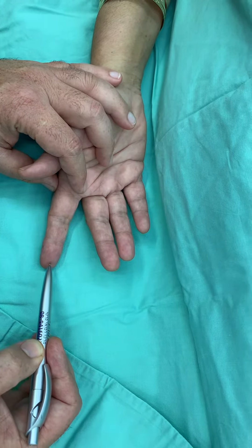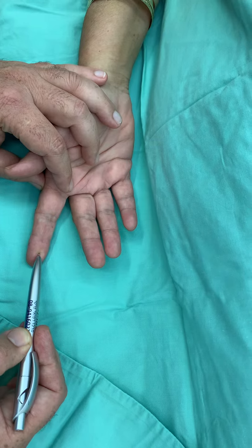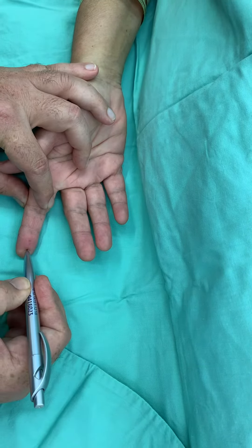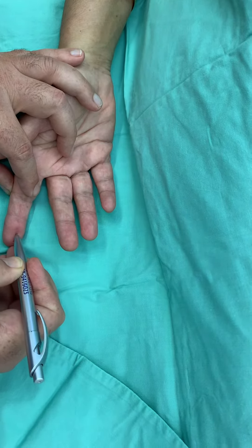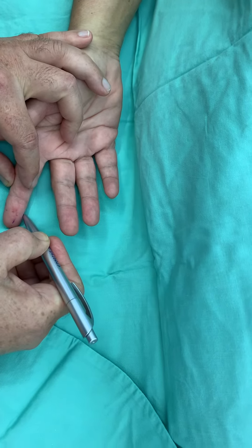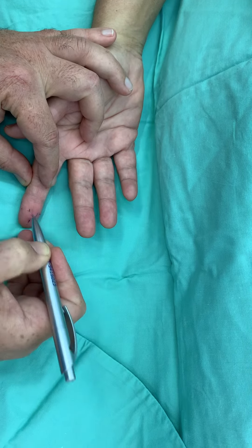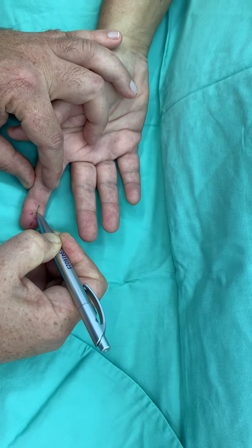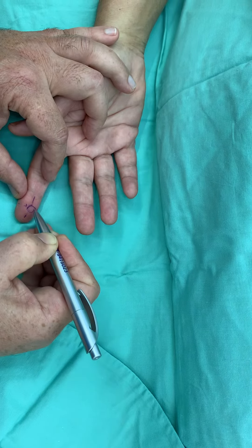She will tell us when she is painful. I will be rolling the blunt tip towards the area — as you can hear, she is painful at this point. She is painful here as well, and here as well. So we have this area mapped. This is the area of the glomus tumor, as I have circled here.